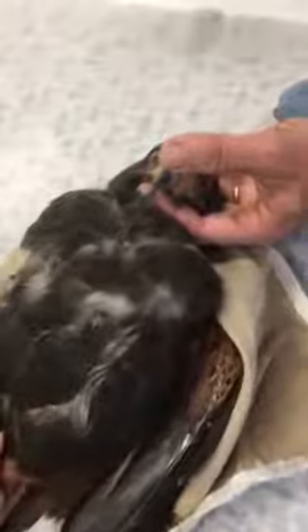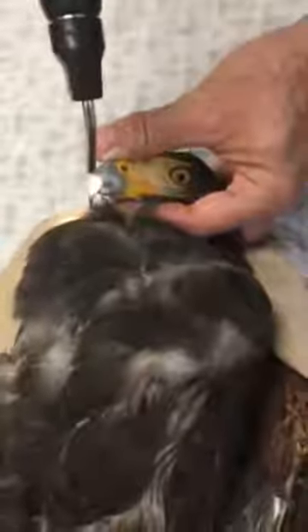This is a Harris's hawk, which is a non-native species of hawk — you would find them out west. Got light reflex. Just like when you go to the doctor and they shine a light in your eye to check for pupillary reflex, we do the same with our birds.